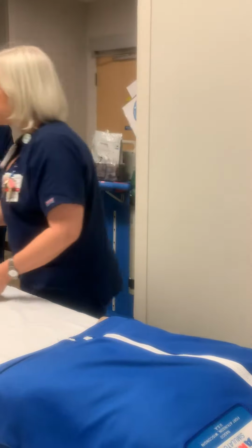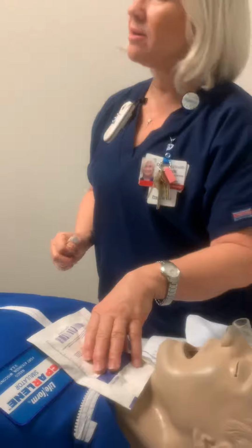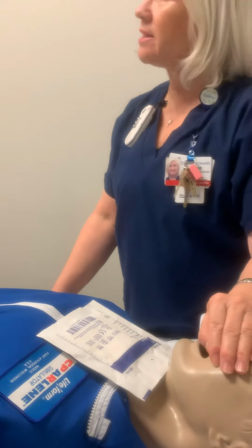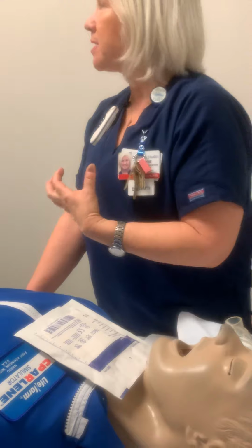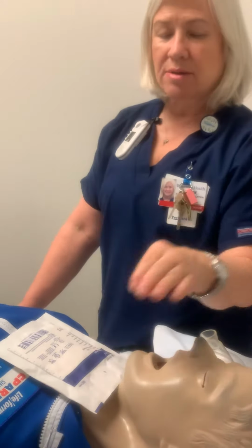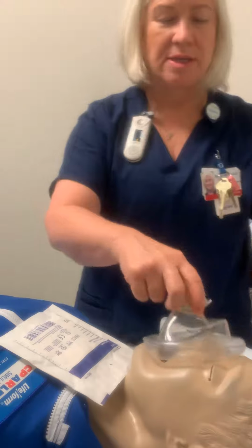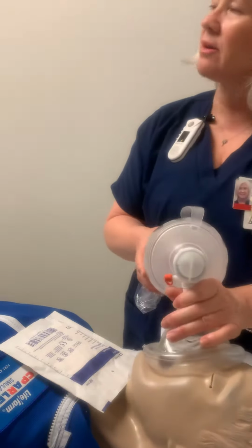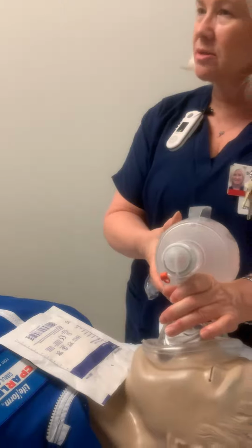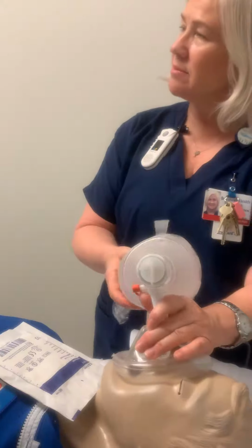So the one thing you want to do is get a 4x4. You can cover it here. Okay, you want to cover it here. Then you can ventilate them here. Okay, so we just have a regular tracheostomy tube. The larynx is intact. It falls out, just cover with the 4x4 and ventilate them here. That's all you need to do. Then you're going to ventilate them here with an adult ambu bag and an adult mask.